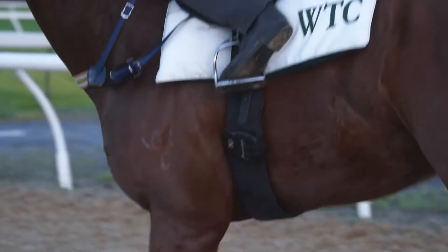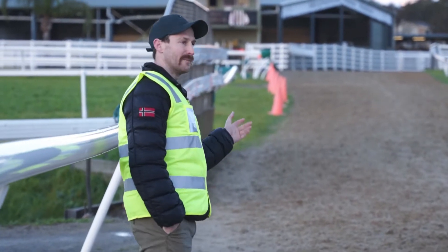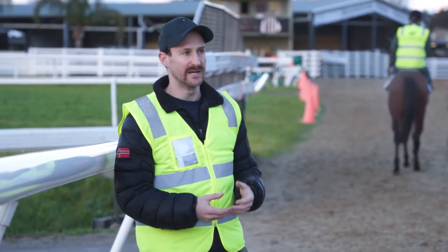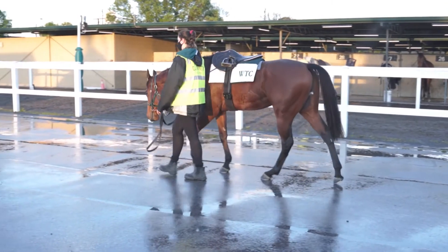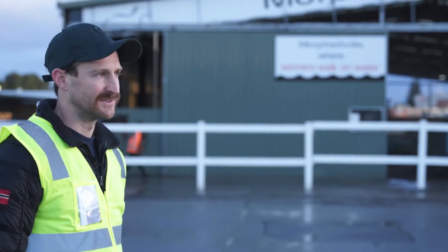Here's Sidearm coming in off his gallop now. We have a look at him, his breathing and his recovery, and then when we go back and look at the data we're able to marry that to the visual interpretation that we have and see whether the data backs it up. Here we have Sidearm having a cool-down walk after his gallop. We like to keep the tracker on for five to ten minutes after they've galloped to get the full profile of their heart rate recovery as they cool down.